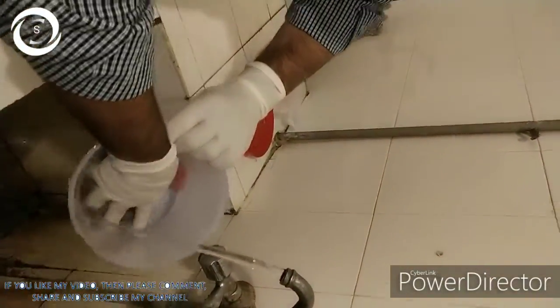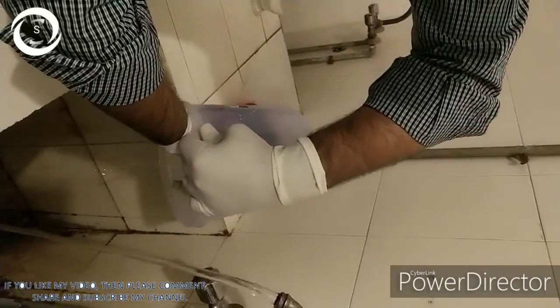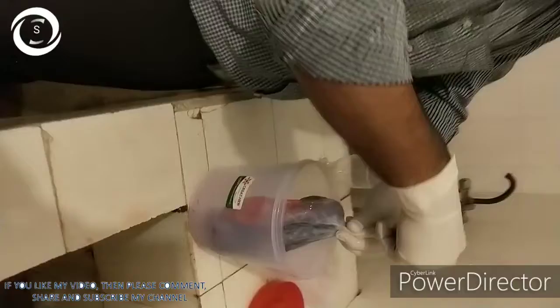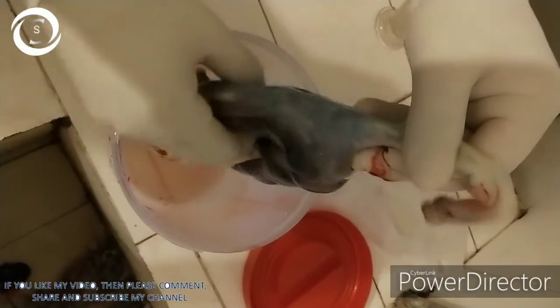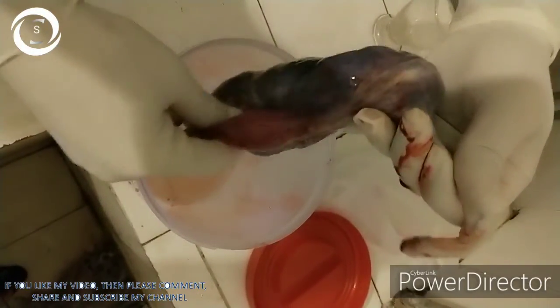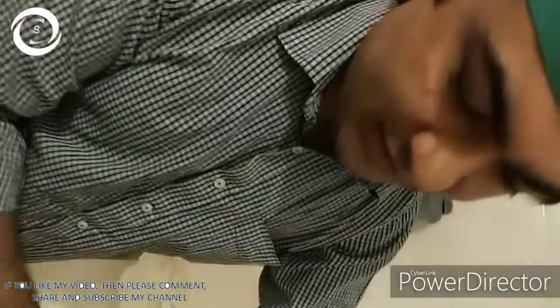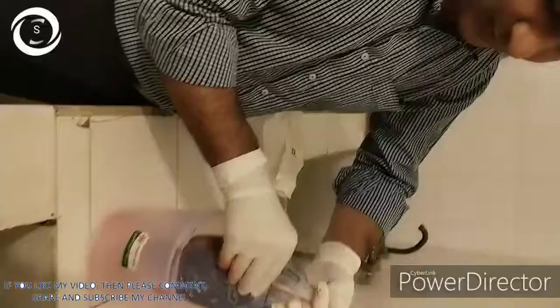Now gently separate it with hands from the placenta by blunt dissection. You can see here the cord connection that is attached to the umbilicus of the fetus.